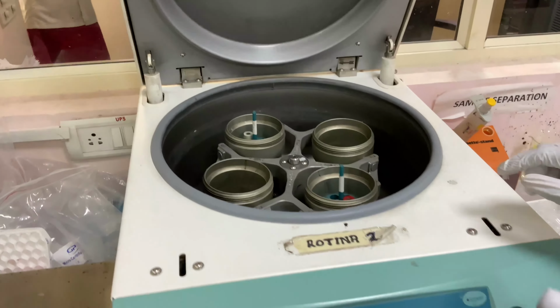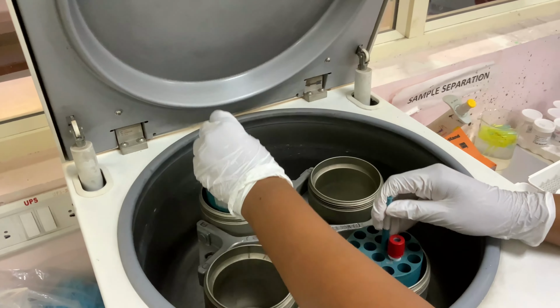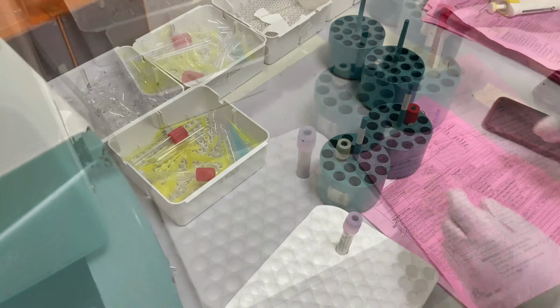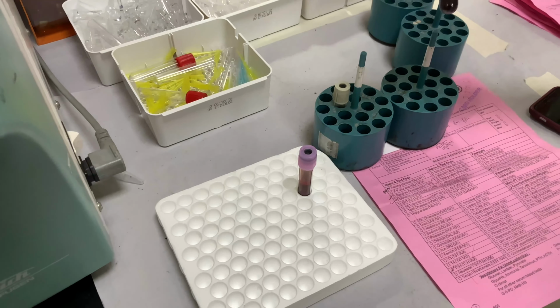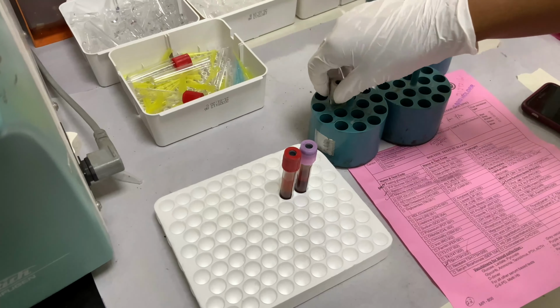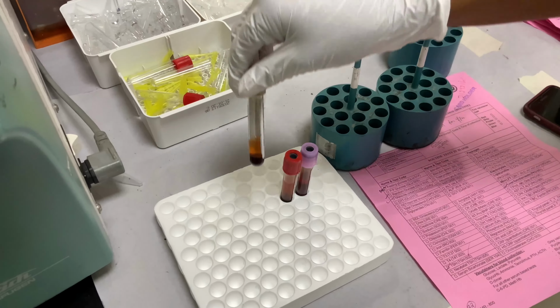After centrifugation, the samples are taken out of the centrifuge and the tubes are checked to see if the sediment or the clot is formed properly and the plasma and serum are clear or not. This ends the pre-analytical phase.